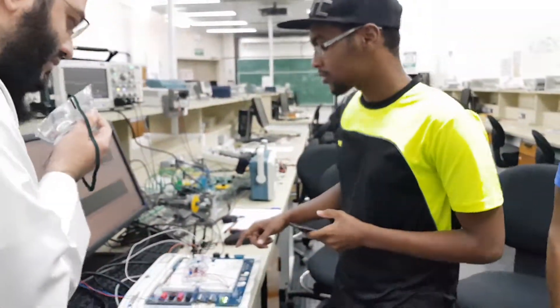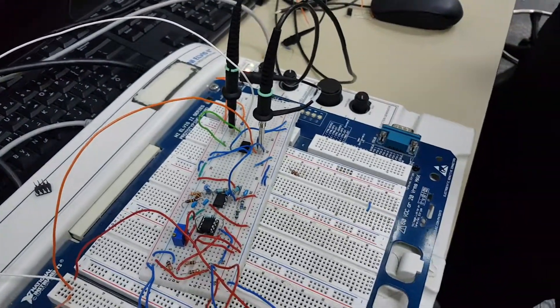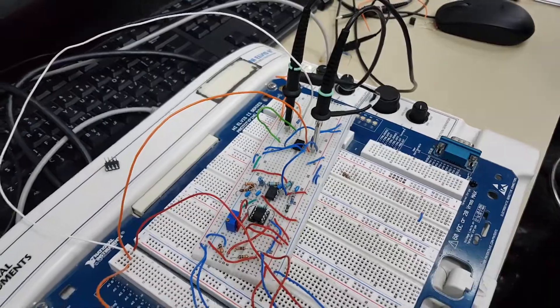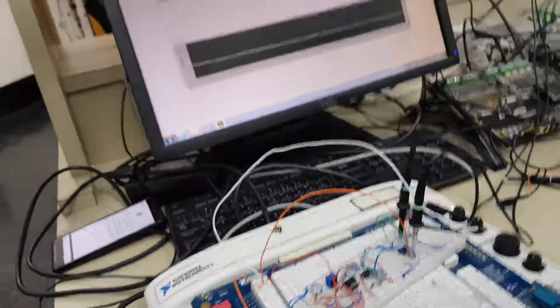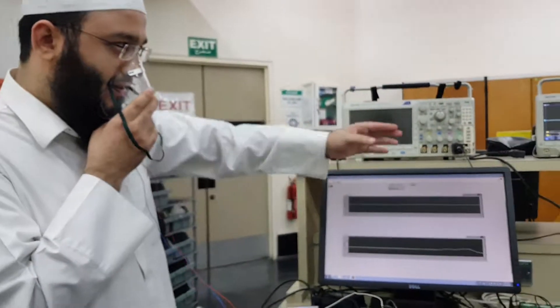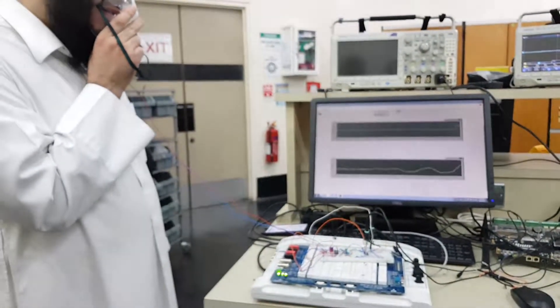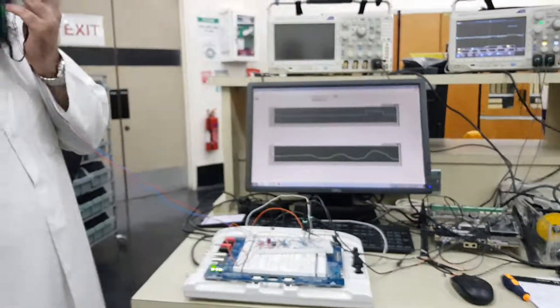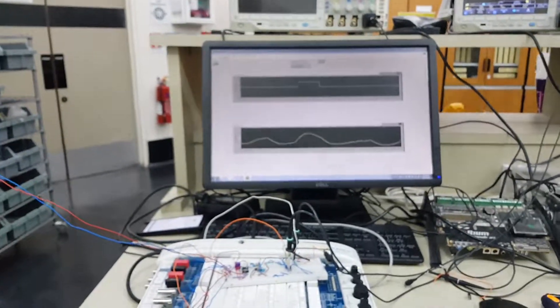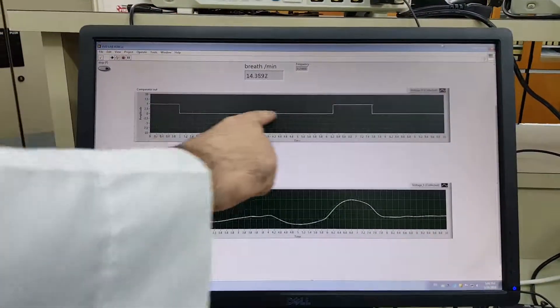The output will go to the comparator. The comparator will show a square wave only on the positive side. Here we will demonstrate the output — I am now trying to make the adult breathe here so we can see the period of each breath.